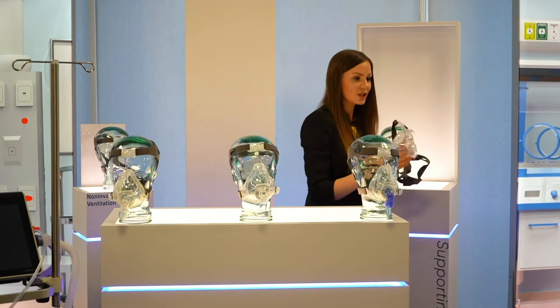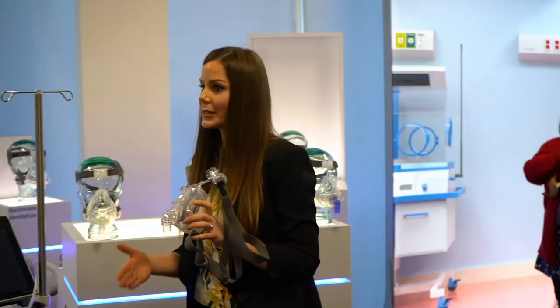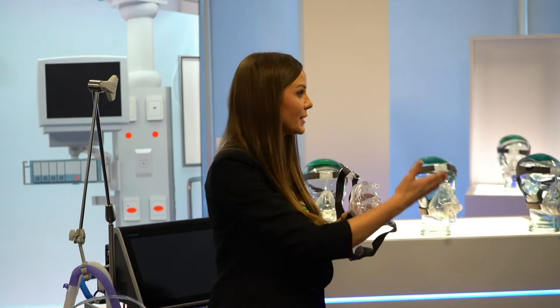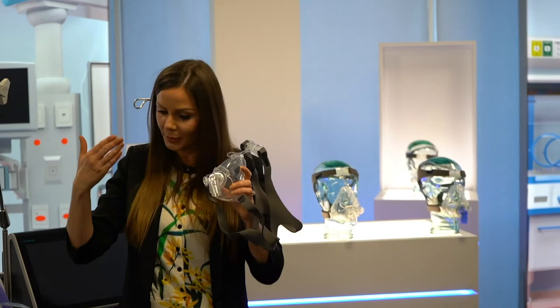And you just nailed it on the head. It's called an AAV, an anti-asphyxiation valve. So we called it different names there. We said safety valve, we said one-way valve, but the correct terminology is AAV, anti-asphyxiation valve. For those that don't know what asphyxiation is, it's where one is deprived of oxygen. It's where they're suffocated, which you used that term there. And that can lead to unconsciousness or could lead to death. Because your patient would be there with no flow and rebreathing their own CO2. And after 3 minutes, a patient rebreathing their own CO2 could become quite fatal. So a very, very important safety feature.